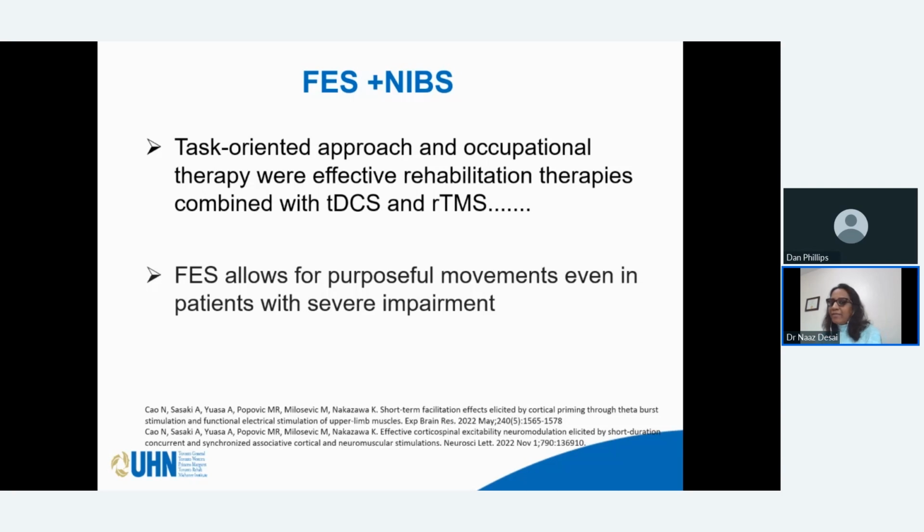So where does FES fit in this scenario of rehab plus NIBS? Personally, I feel that a task-oriented approach is very important to regaining function. And that's where FES has an edge over NMES techniques. What systematic reviews have also shown is that NIBS techniques, when used in combination with specifically a task-oriented approach or occupational therapy, tend to produce better results. So this is an affirmation of the fact that a task-oriented approach is really very crucial.